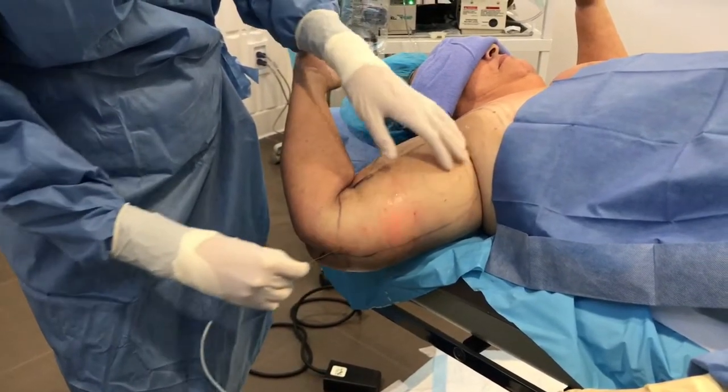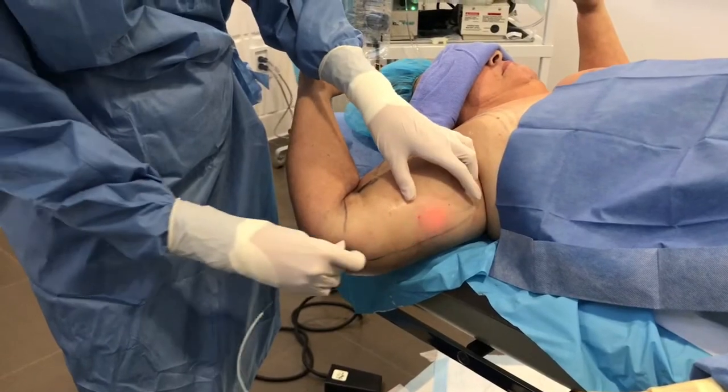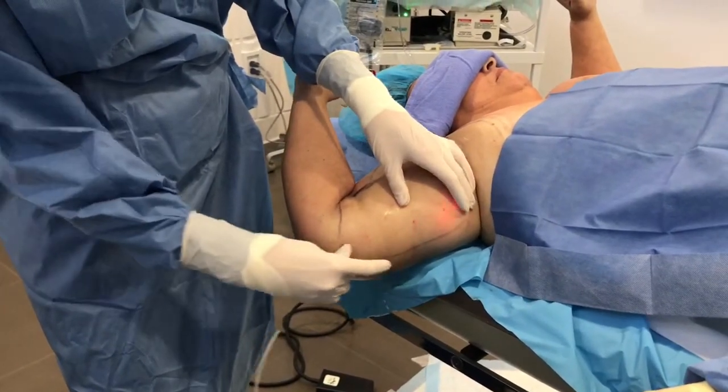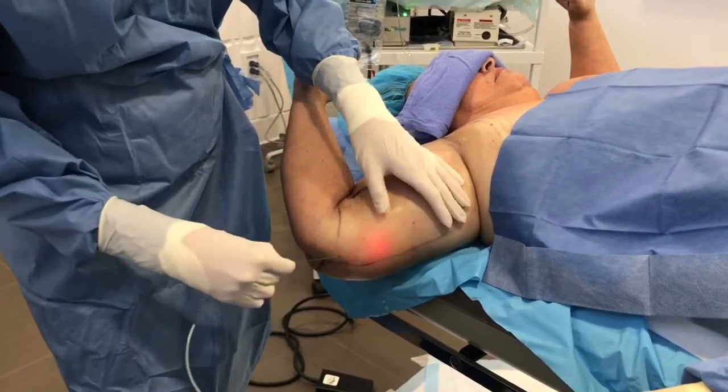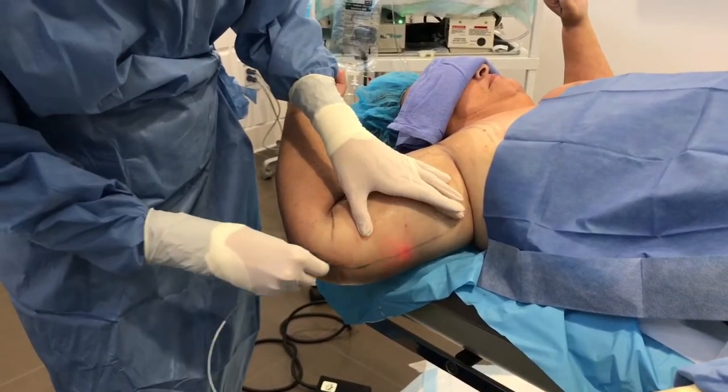I'll end up spanning this entire area. This procedure takes maybe about 10 to 15 minutes on either side, and it also helps prepare some of the fat so I can remove it a little bit more easily when we do the liposuction.